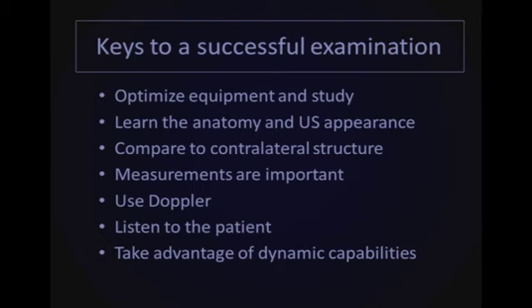Here I have a list of keys to a successful examination, and while some of them may seem intuitive, I thought to list them, but also will be showing some examples during this talk.